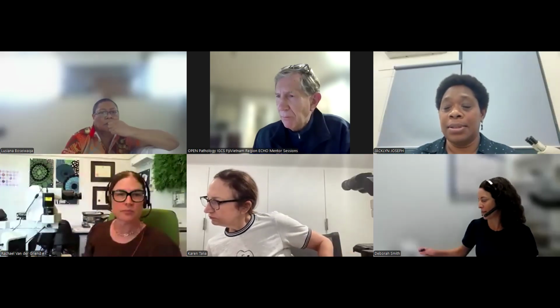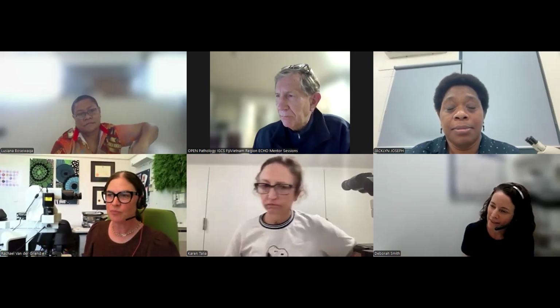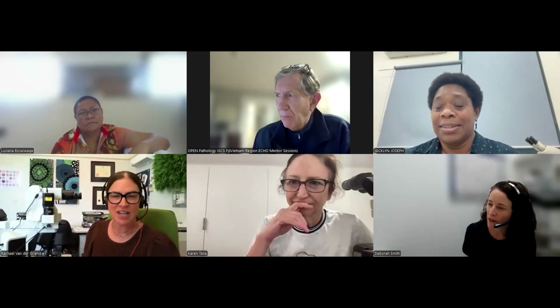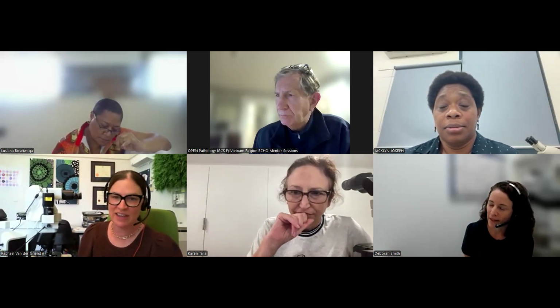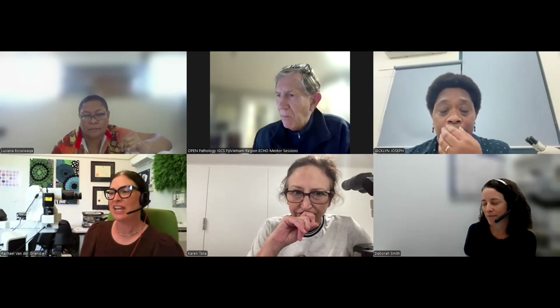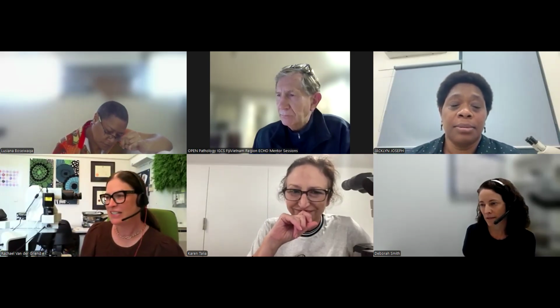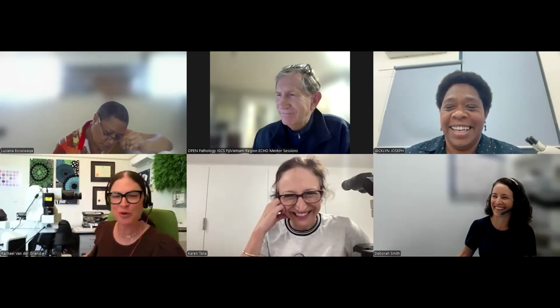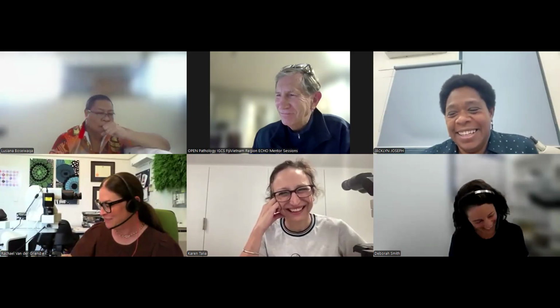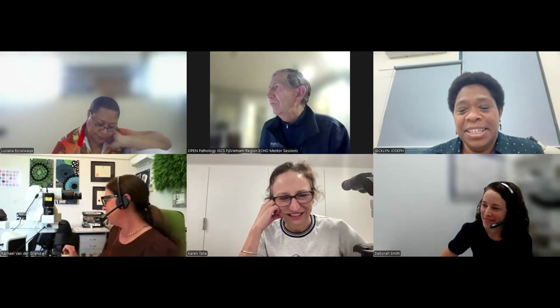Very cool. Thank you. That's actually quite tough because it's quite sort of compressed looking. Yeah, it'd be hard work without IHCs. Well, definitely, and the history of the previous disease and the AFP and the HCG. Yeah. But yes, I mean, it's pretty non-specific, isn't it? Yeah. My heart sank when I looked at it the first time, but all became clear with the immuno. But so, we cheat where we can.